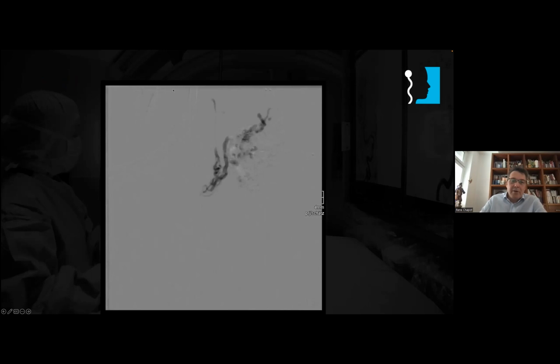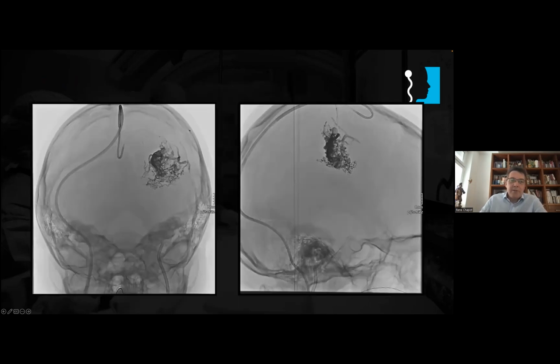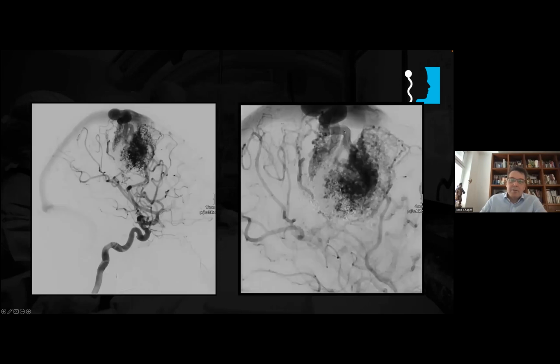And this is very interesting because this is a distal transmedullary artery coming from the anterior cerebral artery going transparenchymatous. I mean, transmedullary means it goes all the way from the cortex down. And here is the shunt. This is an artery, here was a vein. And you see that we're just occluding the shunt, and we're not occluding the normal arteries. So this is after first transvenous embolization. This is the result.